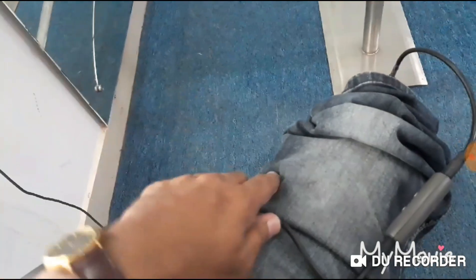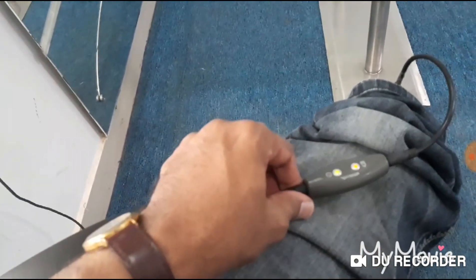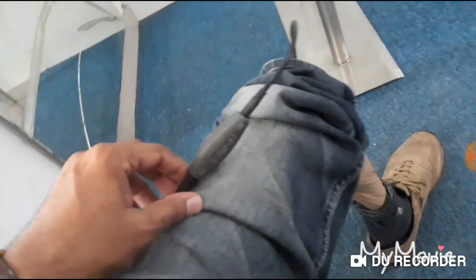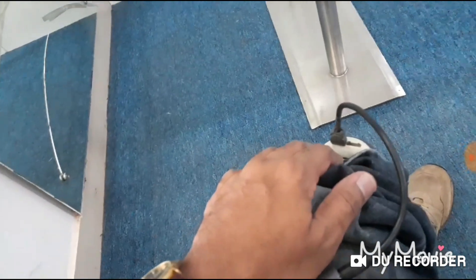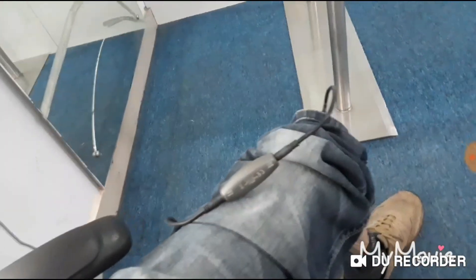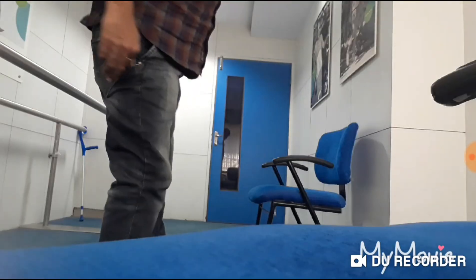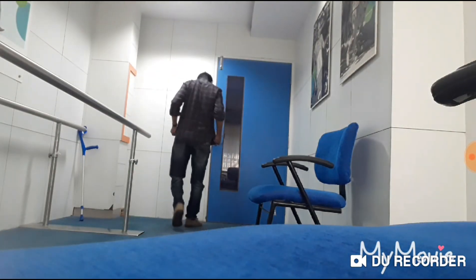Finally they gave me a spare charger. Thankfully it is working and the C-Leg is getting charged. After 15 to 20 minutes of charging, my knee lock will get free and I can go to my destination. Further charging can be done overnight or whenever you are free.